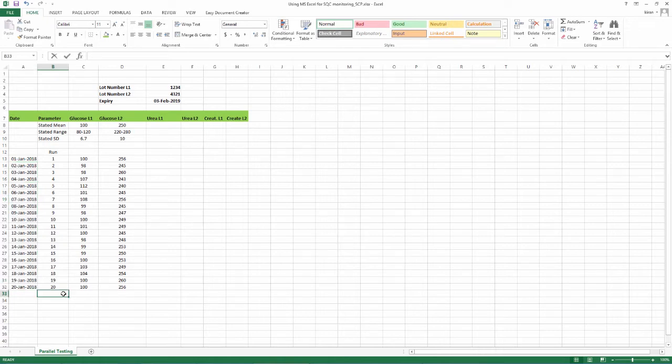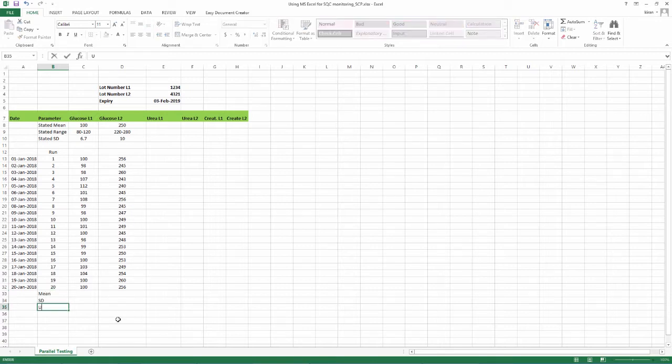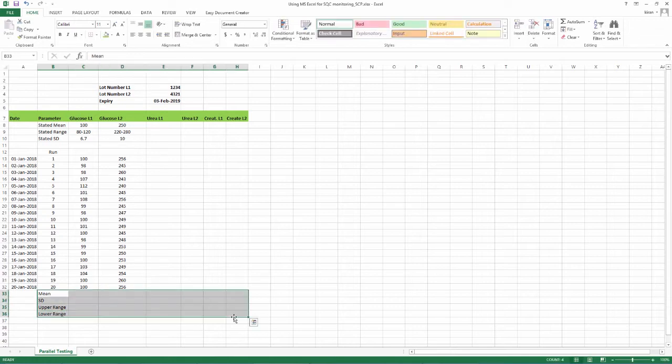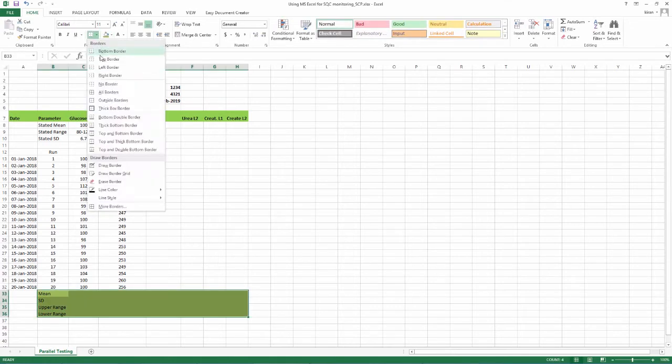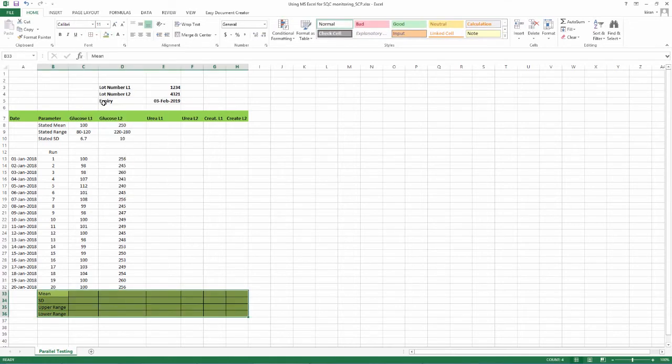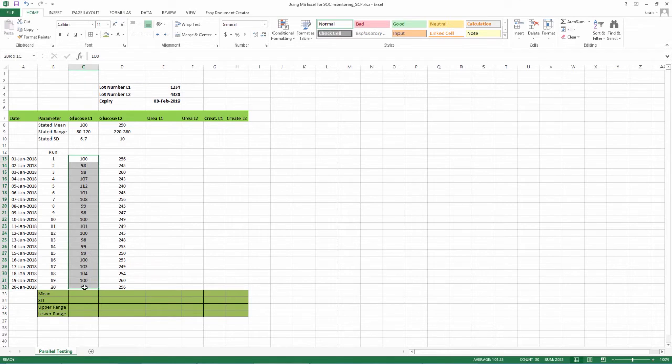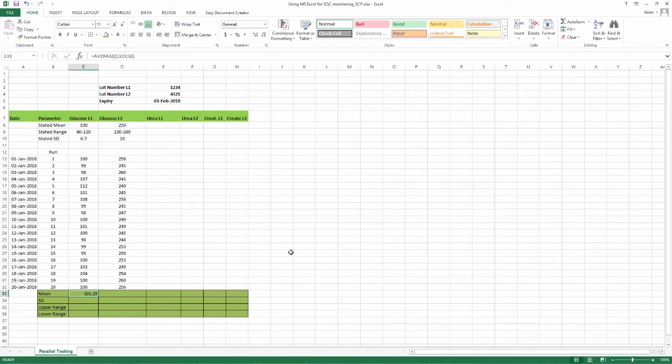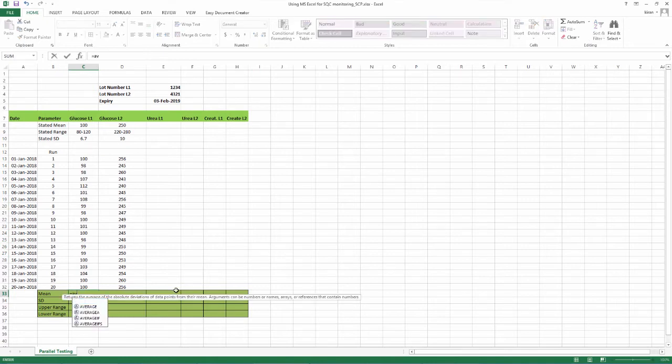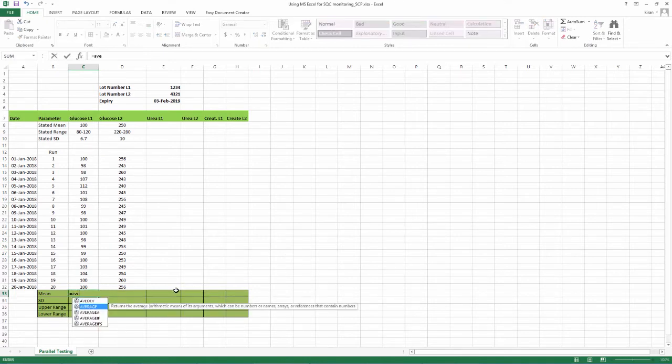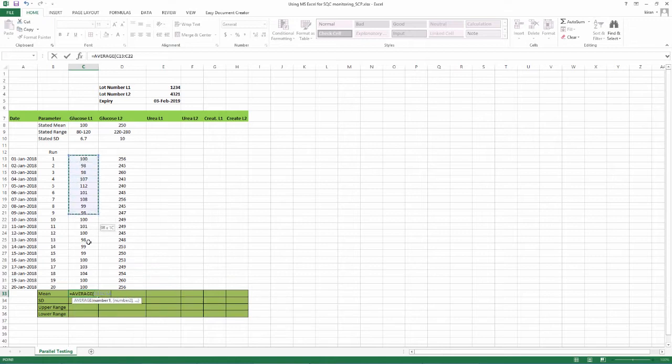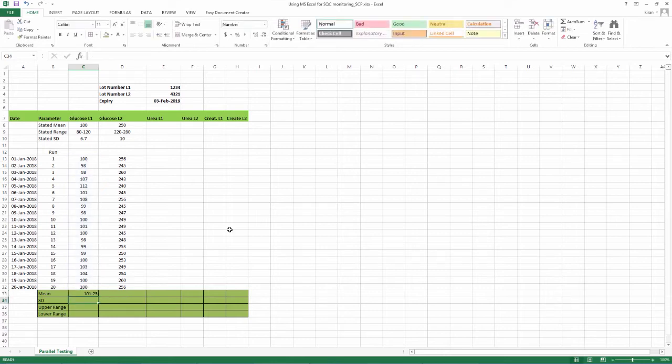mark 4 rows as mean, SD, upper range that is plus 3 SD and lower range that is minus 3 SD. Now select all cells under L1 of glucose and go to sigma on the toolbar and click on average. Alternatively, insert equal to symbol, type average, open bracket, select the cells from run 1 to 20, close bracket and press enter. The mean value is calculated by the system and value appears against the row which says mean. This is the mean for glucose L1 for 20 runs.